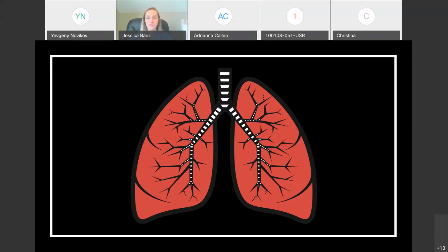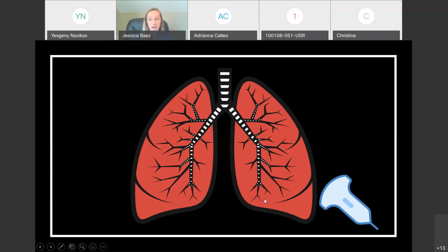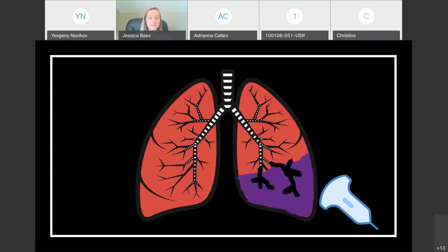So you have your lungs, normal lungs full of air. You put an ultrasound probe on them, and normally your ultrasound beams, as I mentioned earlier, hate air, they get scattered by air, so all you see is the pleural line. You really don't see anything deeper to the pleural line because the ultrasound beams are scattered because of the air. Once you have diseased lung, though, consolidated lung tissue, the beams can now travel through that tissue, so they can travel deep, and you can see some of the deeper structures like the bronchioles. If the bronchioles appear anechoic or black, what is anechoic on ultrasound?